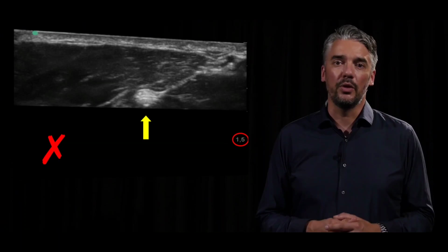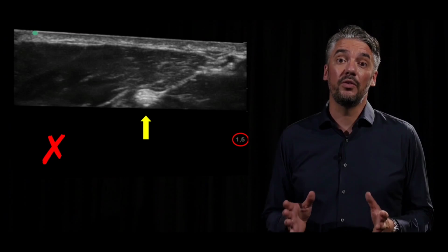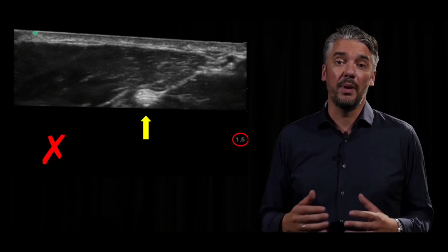If the depth value is too low, the desired image could be truncated, or there can simply be insufficient contrast from surrounding tissues to provide adequate perspective.